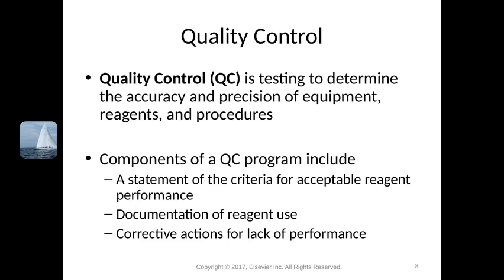So we need to make sure that if we have procedures that are written to these package inserts, that we check to make sure modifications weren't made. For a lot of our antigen typing of the red cell units, when we're doing the other blood group systems, our other antigens, we're going to be probably following the manufacturer's inserts.